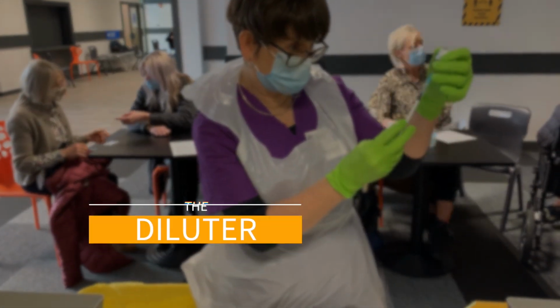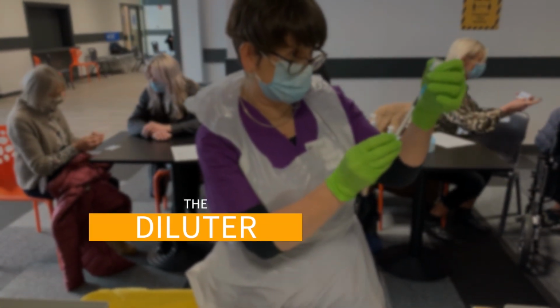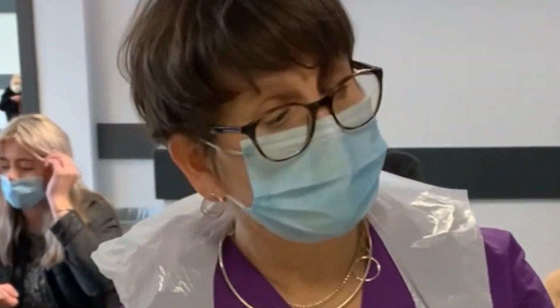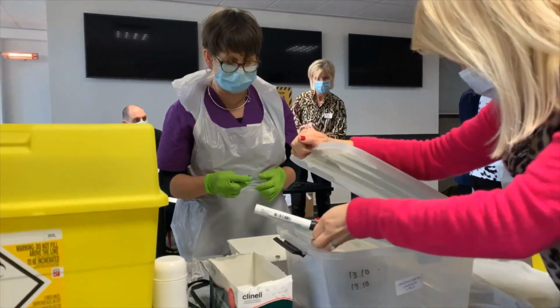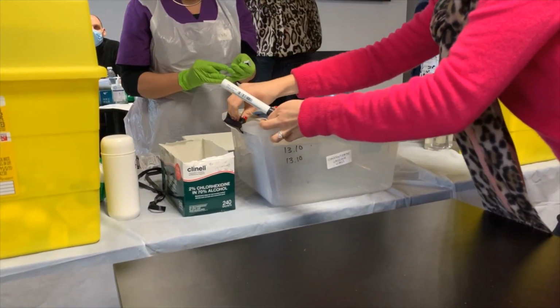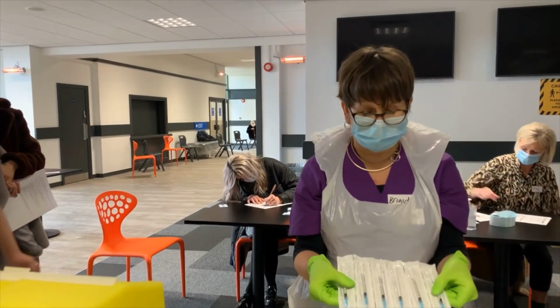Let's start with the diluter. The diluter stands at the middle of the table and is responsible for accepting vials of vaccine delivered to them. These vials are placed in the plastic lidded box on the table. There is a 2-hour time window in which you have to dilute the vaccine.